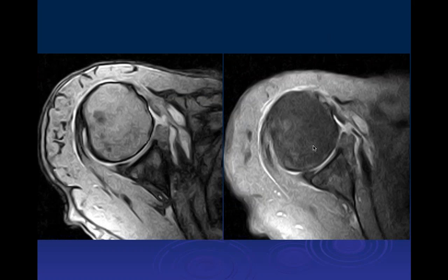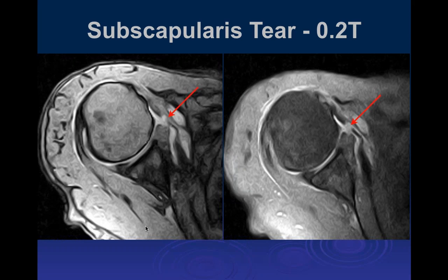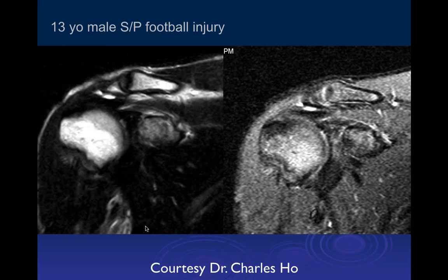On axial T2 and T1 post-arthrogram images the subscapularis tendon appears completely torn and retracted, with fluid filling the gap between the torn ends.